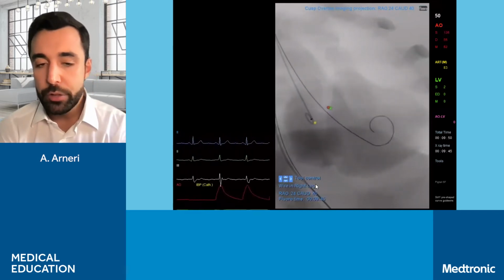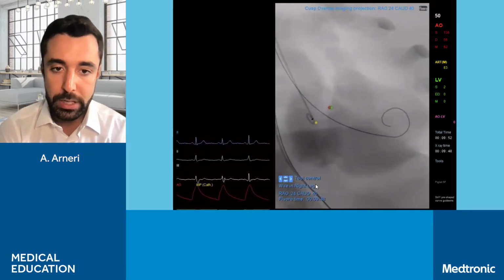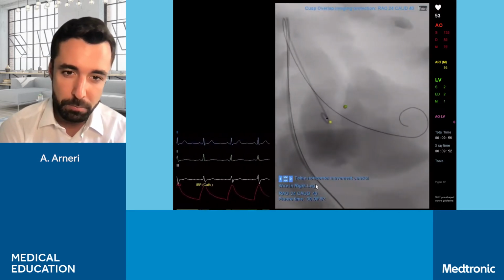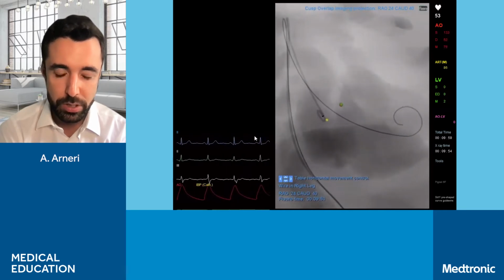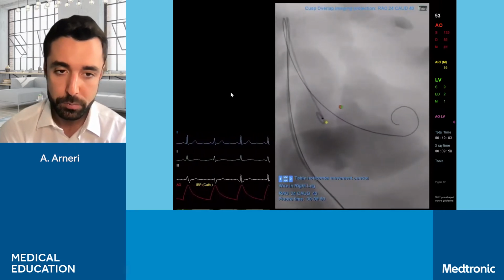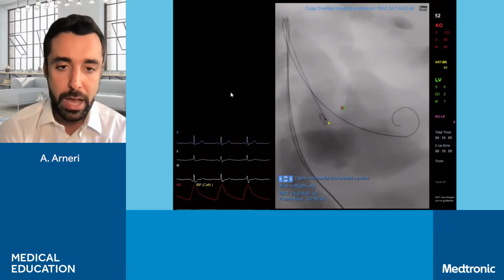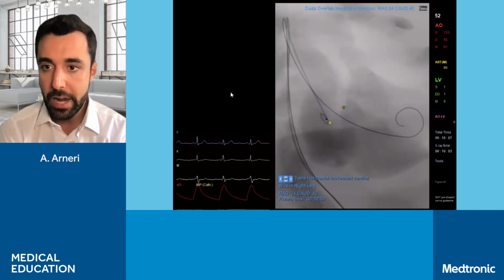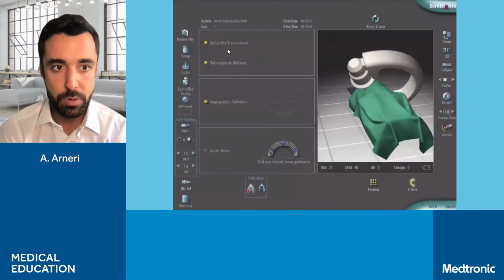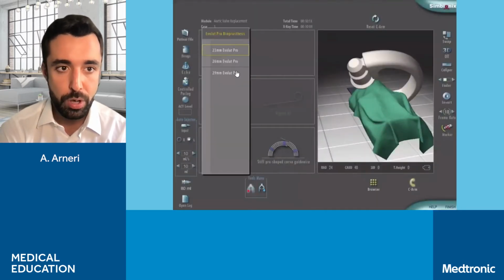Okay, so for this patient, we are not going to do any pre-dilatation because you see we don't see any high degree of calcification, so that's not needed, and it's not even mandatory for the implantation of an Evolut. And we're going now to insert our device into the patient. So we're going to select, as we mentioned, an Evolut Pro 29 millimeter.